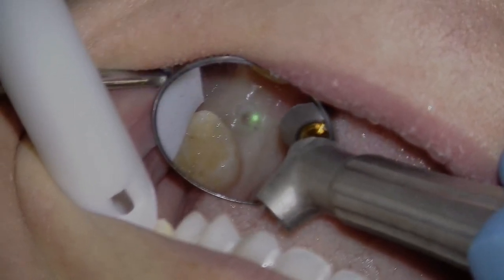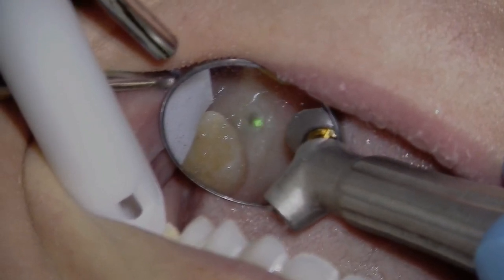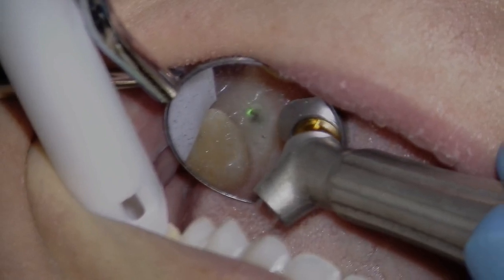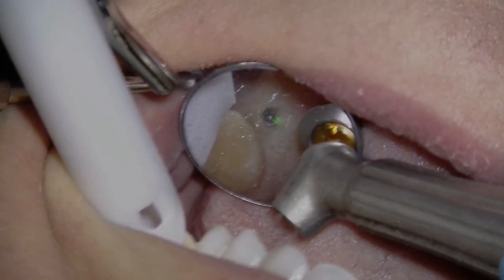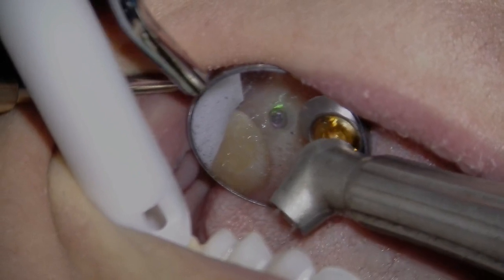A 39-year-old patient presented to the practice with an implant that was placed four months ago after removal of tooth number 14 that had failed endodontically. A crestal approach sinus lift was placed at the same time as the implant for proper bone support. The integrated implant required second stage surgery for the restorative phase to begin.